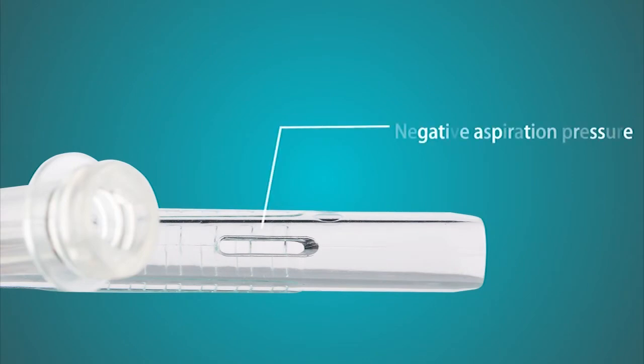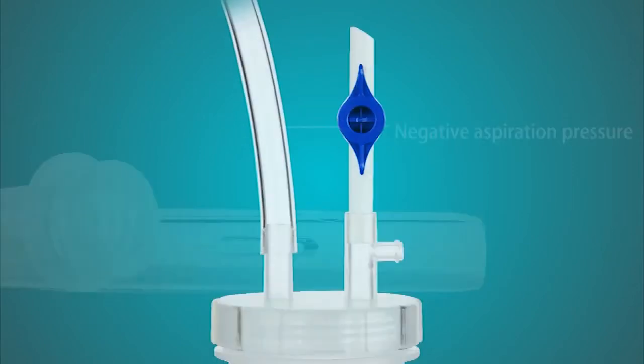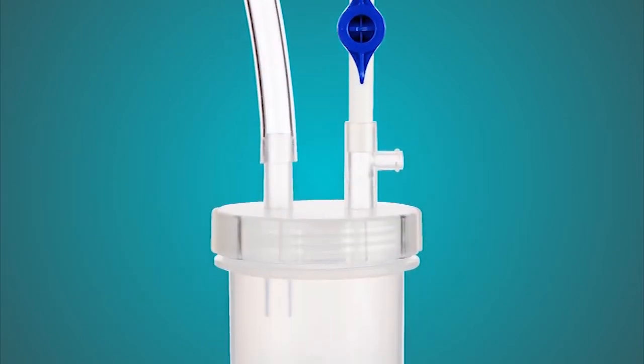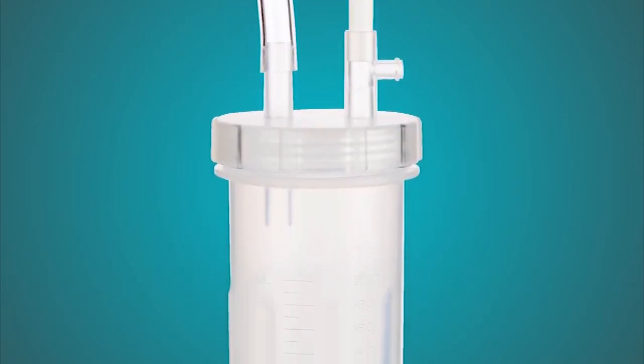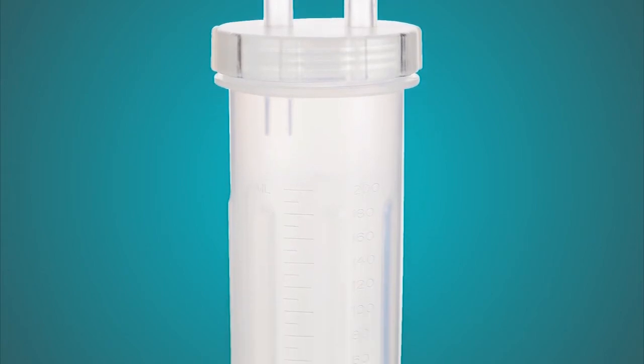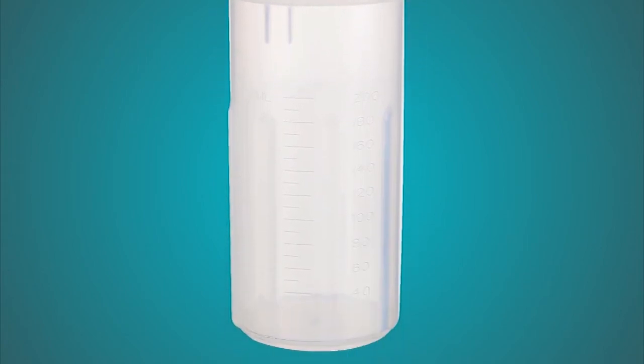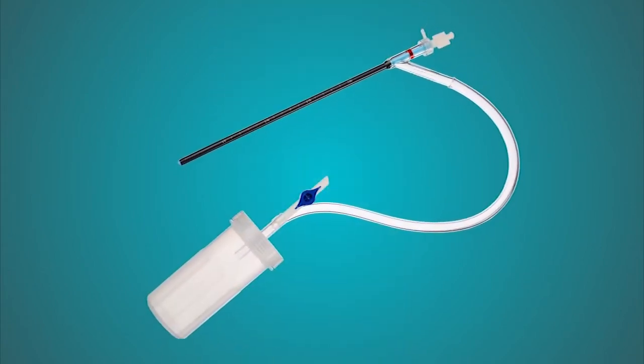The collection bottle is used for collecting the stone fragments. The bottle can be sent directly to the laboratory. Connect the oblique branch of the access sheath to the stone collection bottle using a clear and flexible tubing.